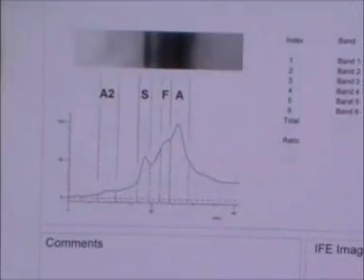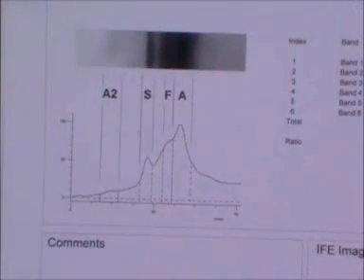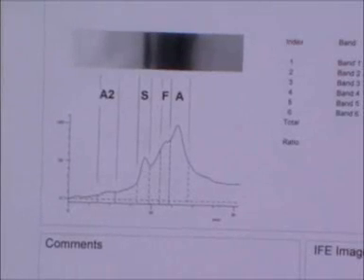And in track 8, in the haemoglobin mixture, as we move from the slow bands to the faster bands, you can see that the scan has identified a weak A2 band, a stronger S band, and strong F and A bands, distinct but close to one another.